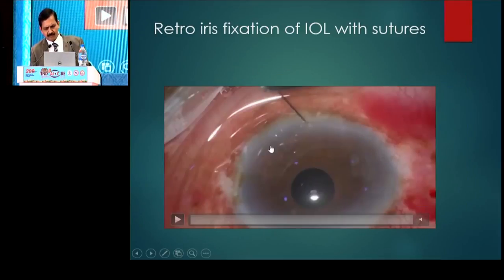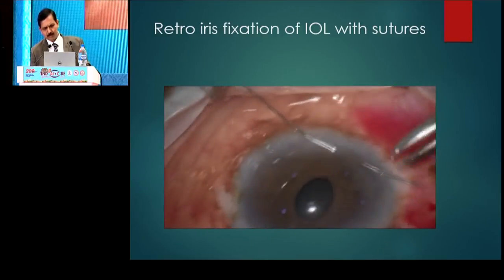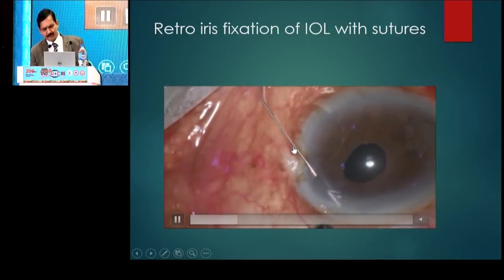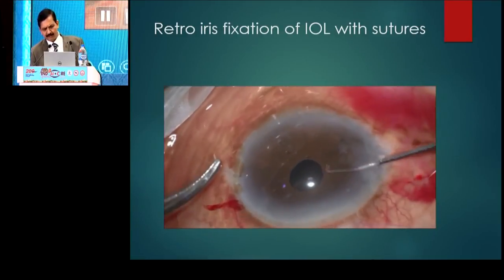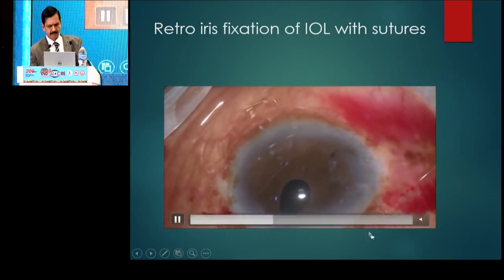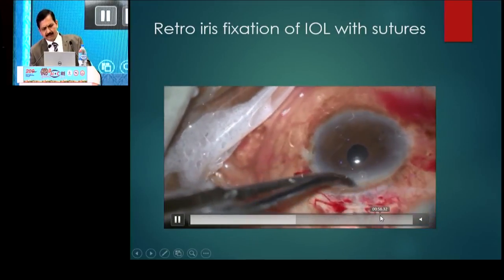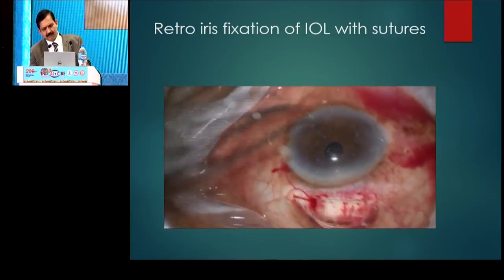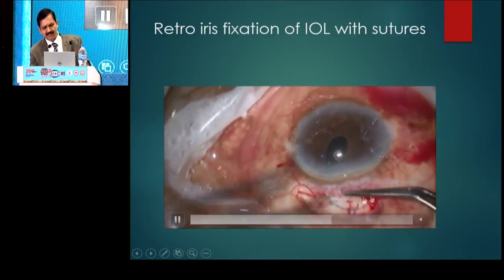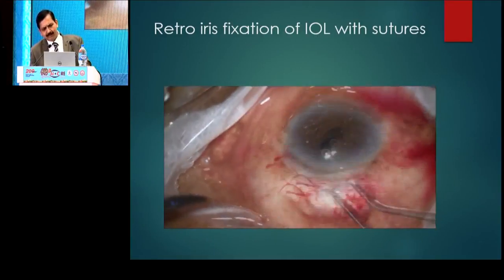This is another case of pseudo-exfoliation where there is no capsule or bag at all. This is a different technique of suturing the lens. The needle is passed through the mid-periphery of the IRIS, or a little closer to the peripheral part of the IRIS on either side. Using a Sinski hook, a loop is brought out here. Now using the clove hitch technique to get a firm grip on the haptic. The haptic is secured and the whole thing is placed, with the suture tied the same way as shown in the previous video.